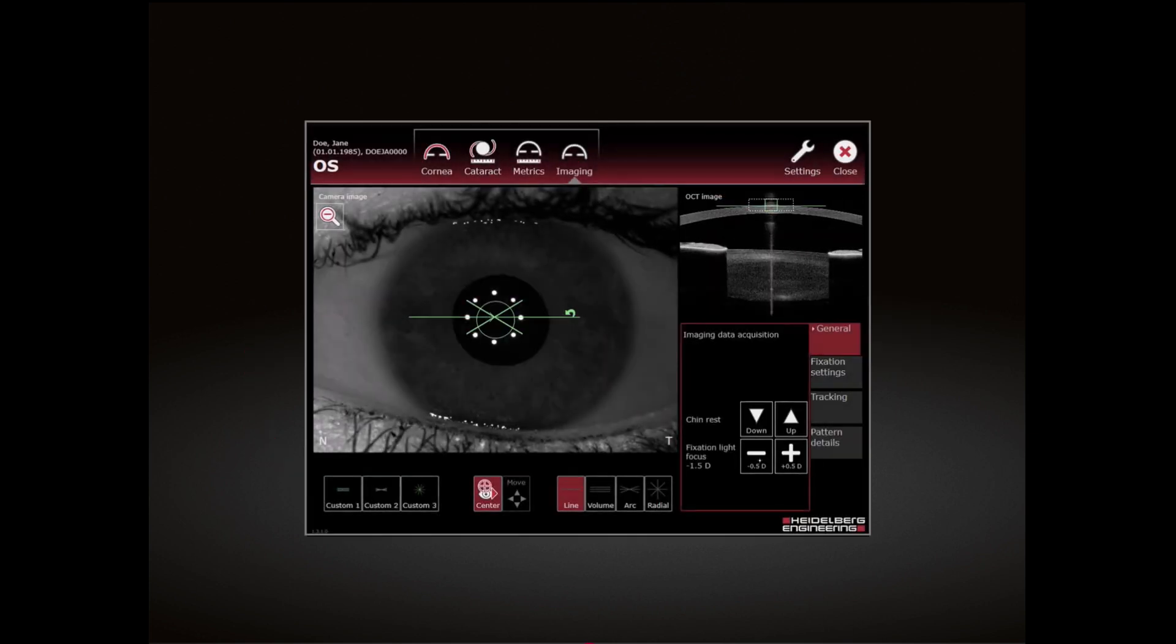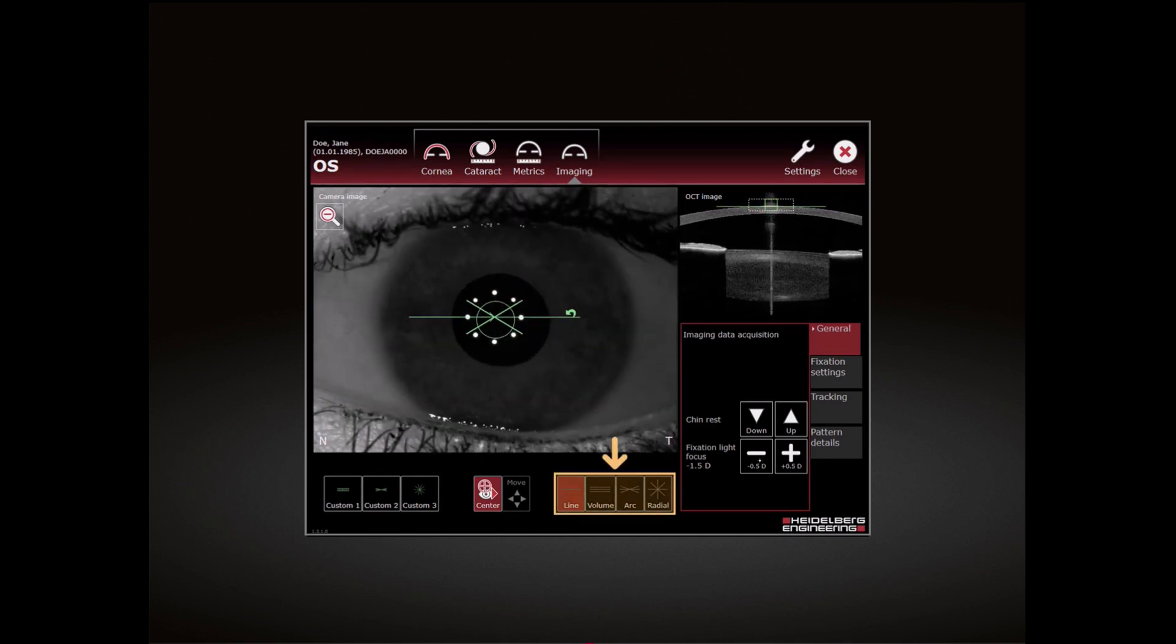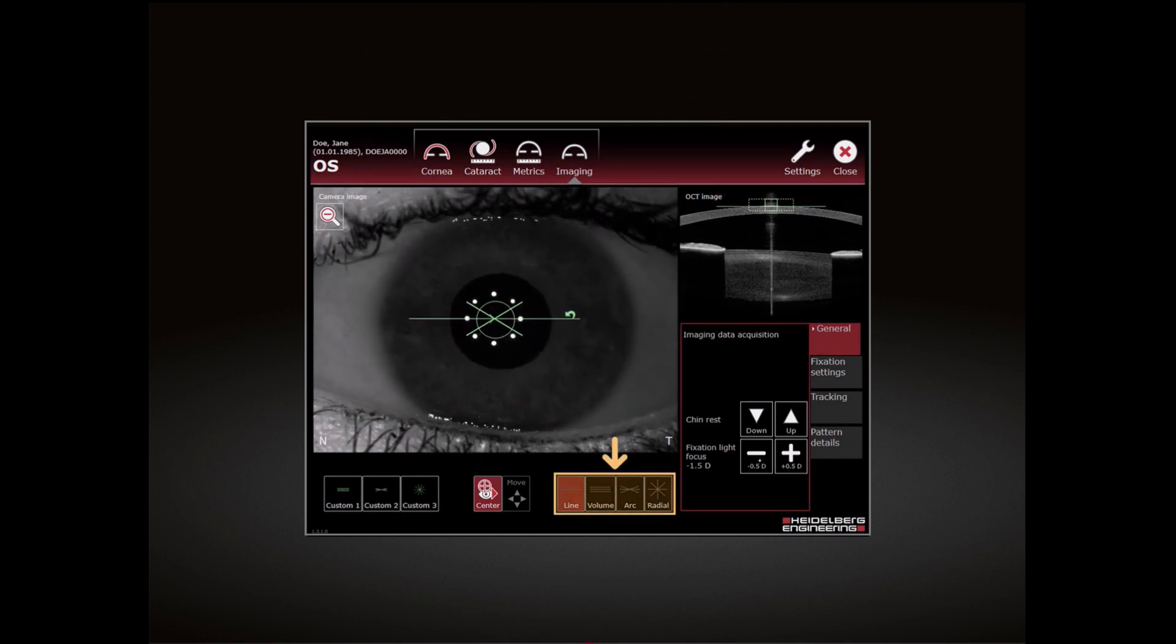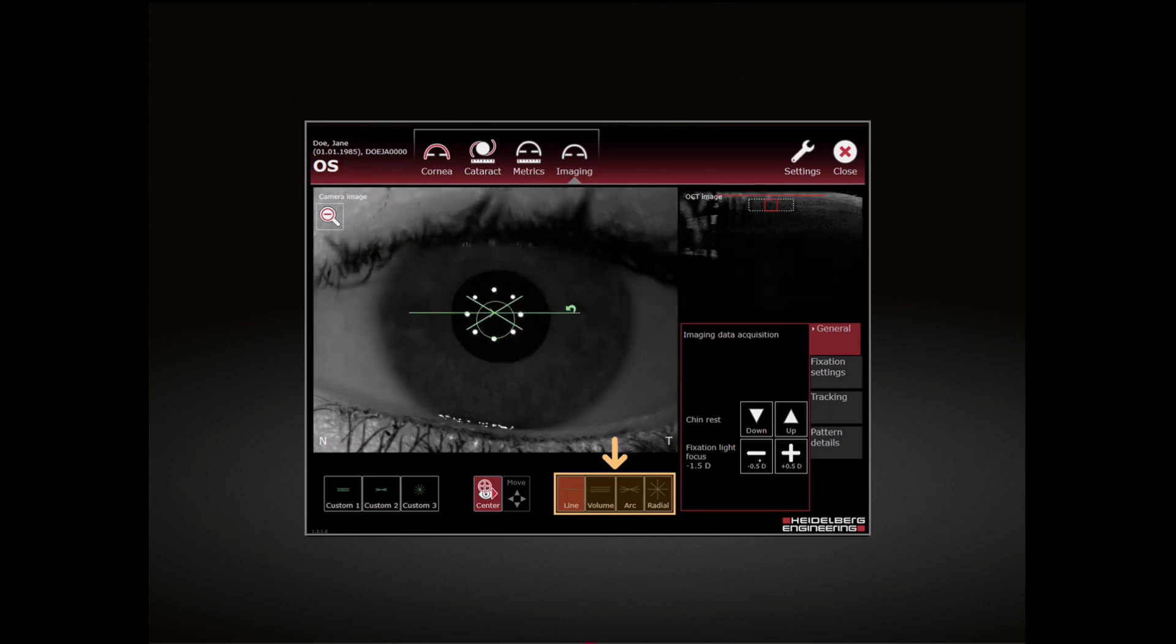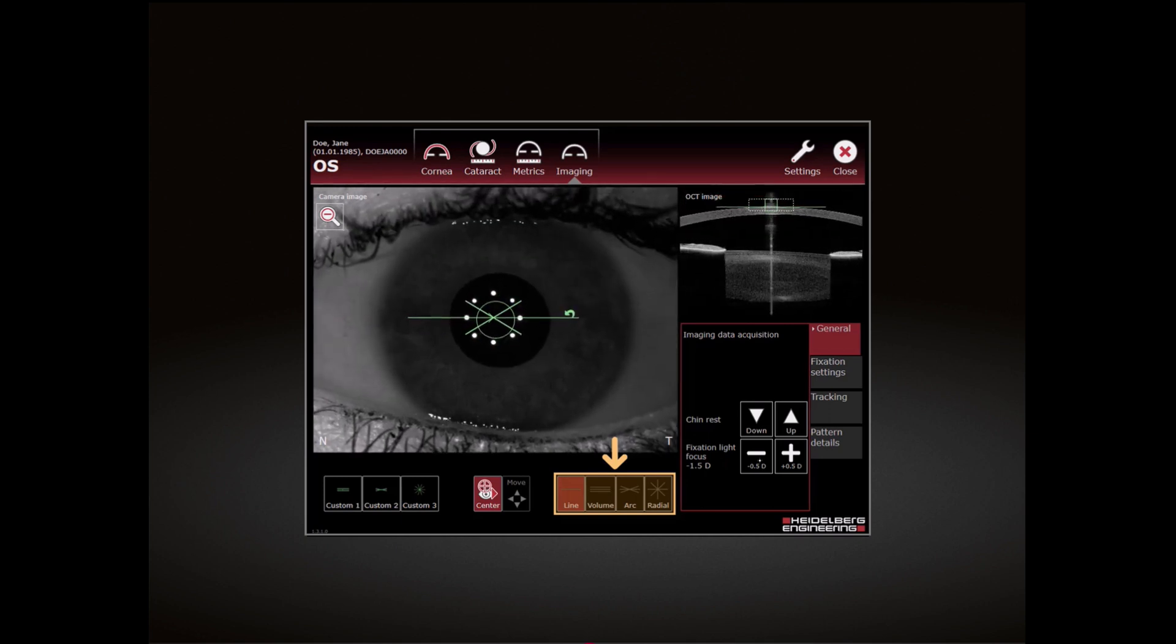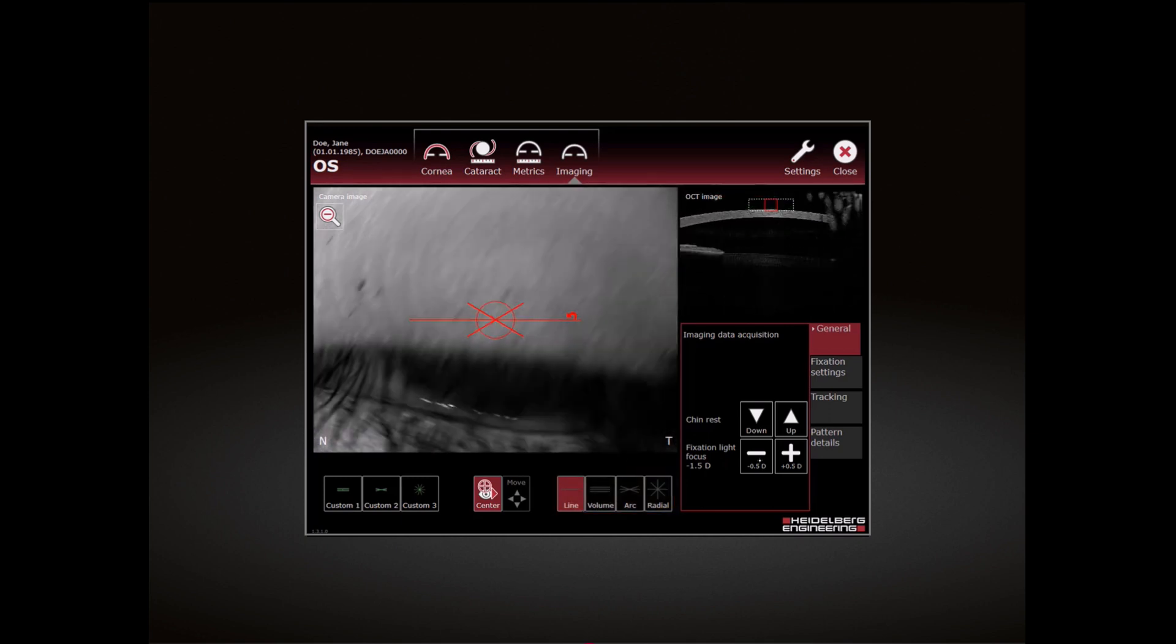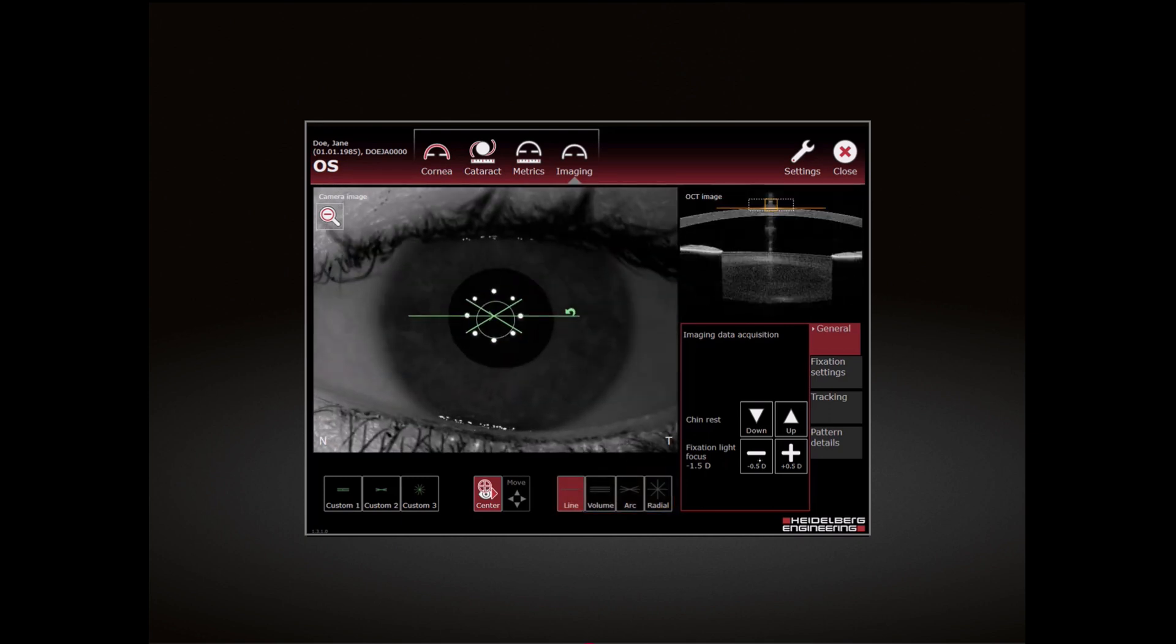The Imaging App provides four scan patterns. For each pattern, you can personalize the scan parameters. To select a scan pattern, tap on it.